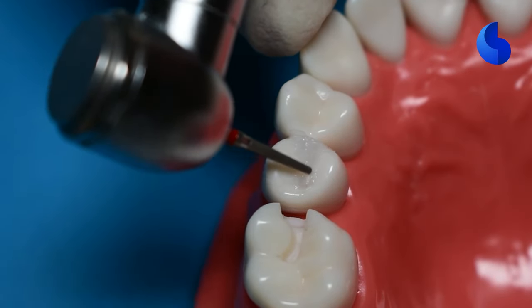We've established a great contact. Premolars usually have the contact on the buccal side of your proximal surface, and that's what we have right here as well.